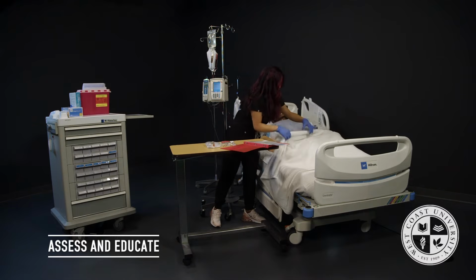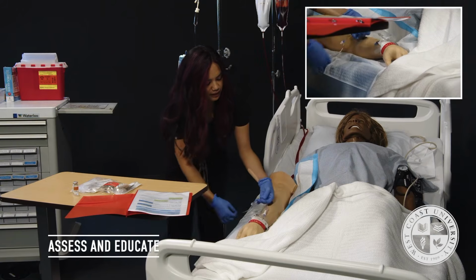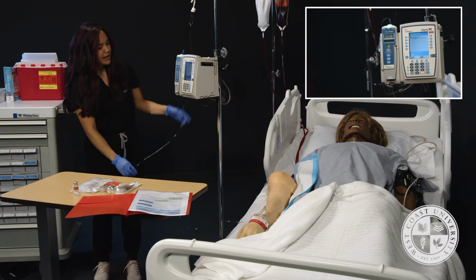And then I'm also going to be checking your IV site, make sure it's not leaking, it's free of any redness, erythema, and making sure that the IV is patent. So as I follow it up to my IV line, I see that it is flashing green. So my IV bag is infusing and it is patent.